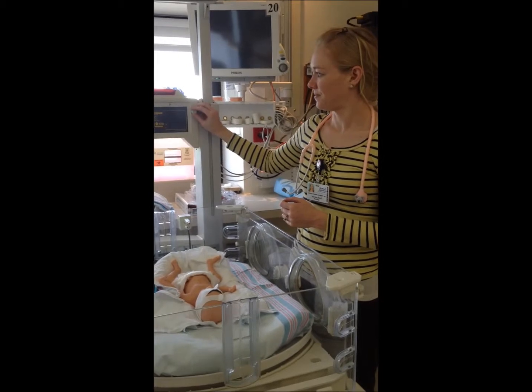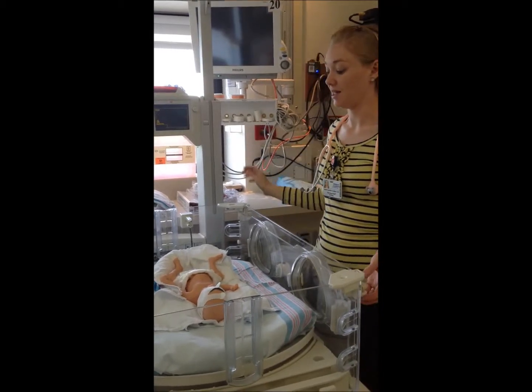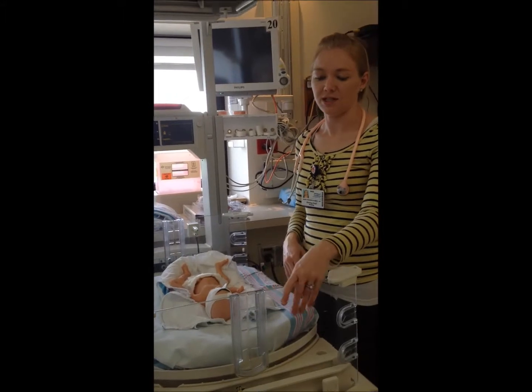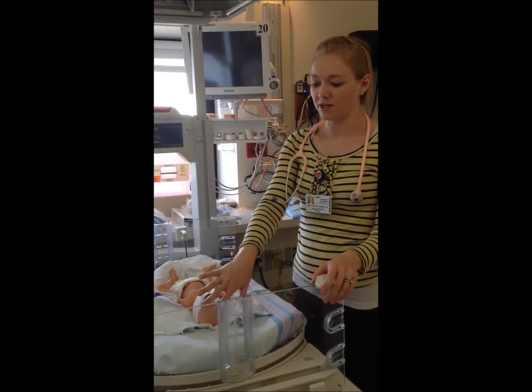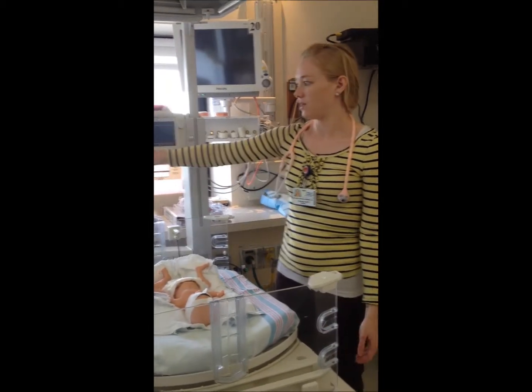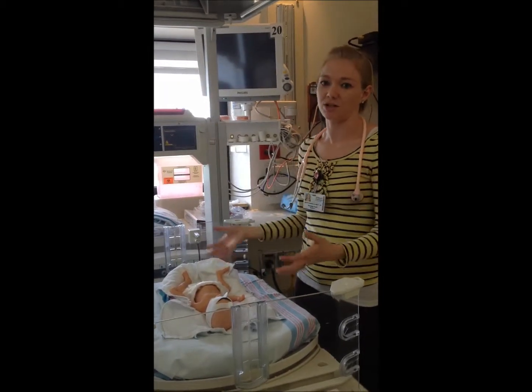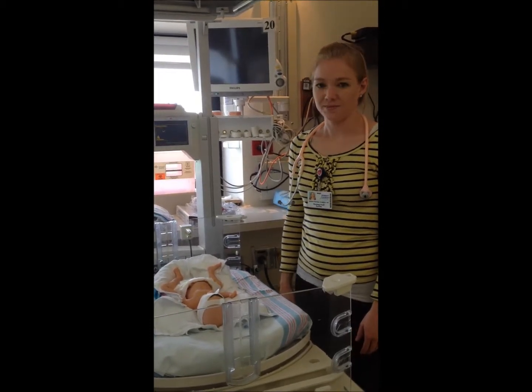Great. Can you show us how you're able to have easy access to the baby with the sides of the giraffe bed going down? Yes. Each side comes down. We could take all three sides down if we needed to. Sometimes we have to take this side down if we're doing special cares for the infants, if they're having something called an EEG that we have to access their heads and things like that, so that's a very nice feature. And there's also a button here that we can push when the top is down that changes the way the air circulates within the giraffe bed so that there are no drafts coming in and the temperature is maintained, the thermoregulation stays the same to keep the baby's right temperature. Because temperature control for these babies is so critical.